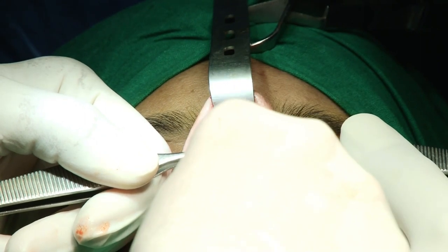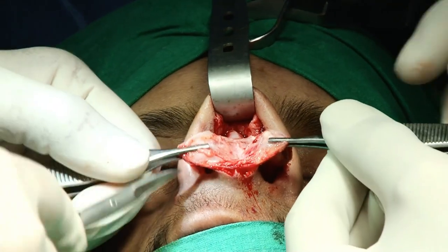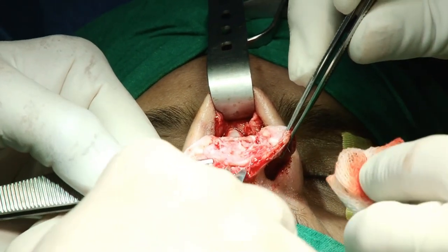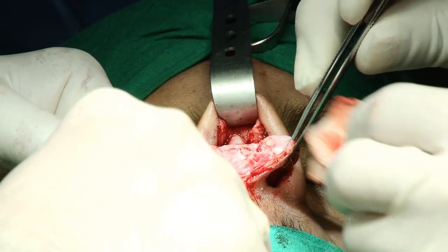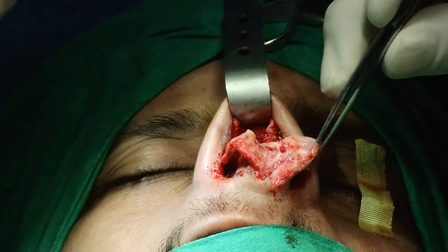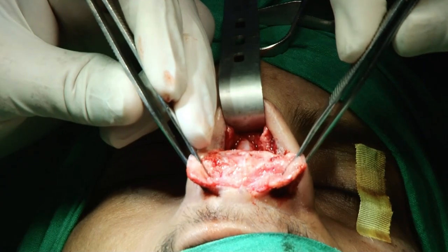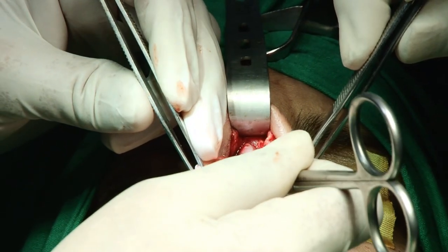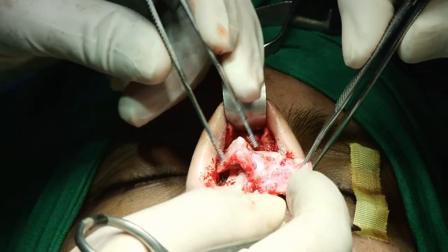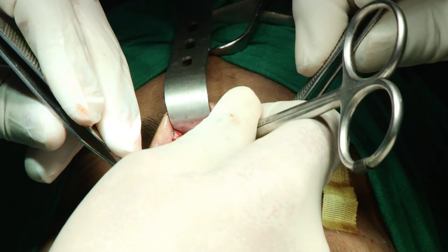This is the suprapericondrial layer of the mid wall, so I cut it to expose. Now we cut it for passing the instrument here. Yes, so we cut it, because this is a badly deviated septum, and the septum is on this side. Now you hold it. Yes, this is the glimpse of the septum. I hold this just in a pen-holding position, like we discussed this morning. Yes, go nearer. When you go nearer, then you find your plane. Okay, now on the other side.